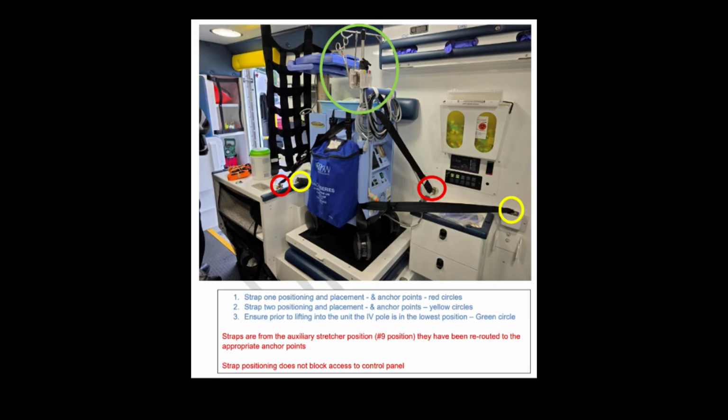EHS is responsible for securing the intra-aortic balloon pump to the seat. This is the only location that it can be safely secured. The IABP screen can be rotated for viewing. You can see it is in the screen circle at the top. In this picture, the screen is actually folded down, but in reality, it will be folded up and then the screen can be turned to face the interventional cardiologist.